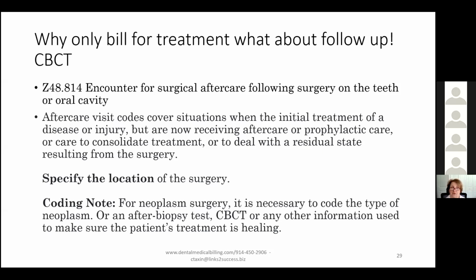You did surgery, you did treatment. Is everything healing? And that's what we have to be looking at more and more. That's another habit dental has that medical does not have. If you're doing oral DNA and then you treat the patient, are you following up with an oral DNA to see if the patient got better?